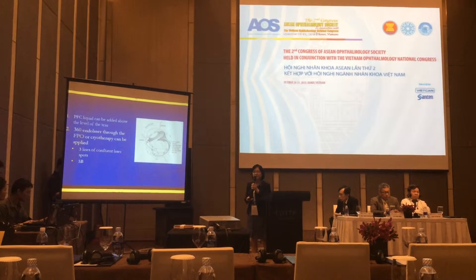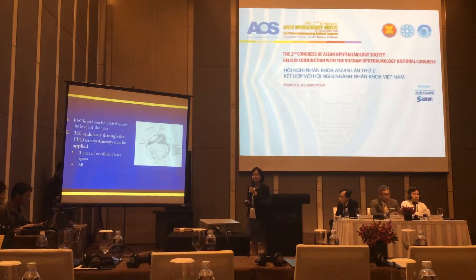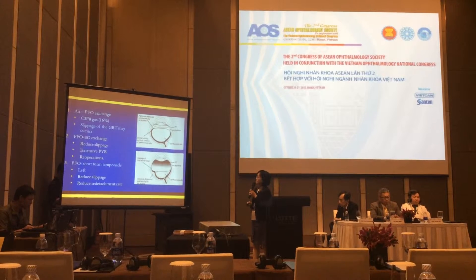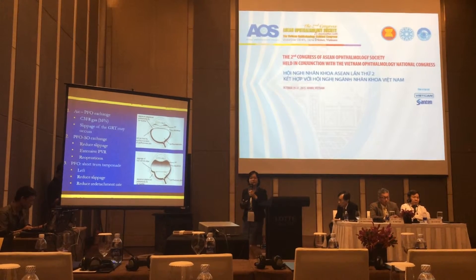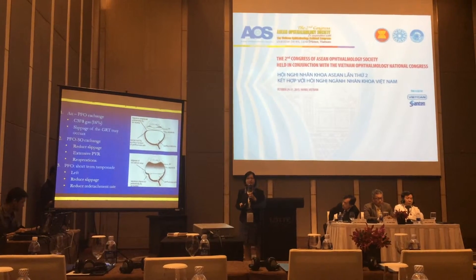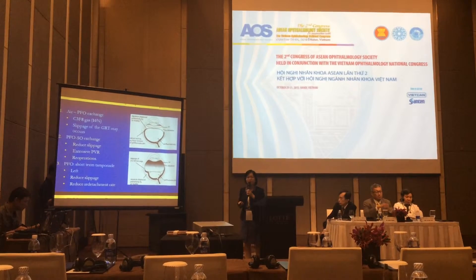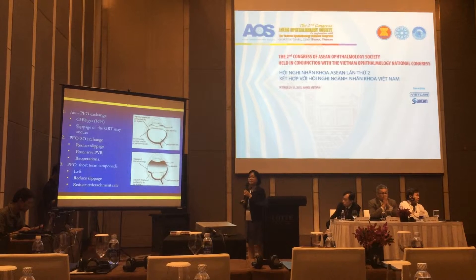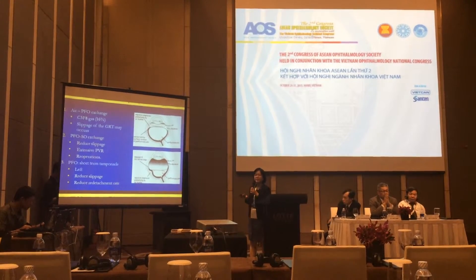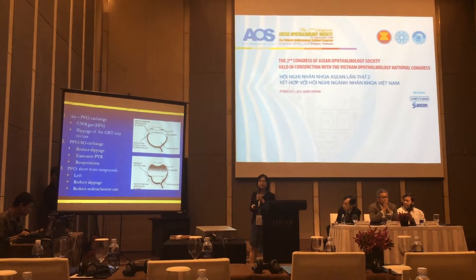After injecting PFCL, we perform 360-degree endolaser or cryotherapy. Finally, we choose the endotamponade. Depending on the case and the surgeon's experience, we can choose gas, silicone oil, or PFCL for short-term tamponade. That means after the operation, I leave PFCL for one week or ten days and then exchange to gas in a second operation.